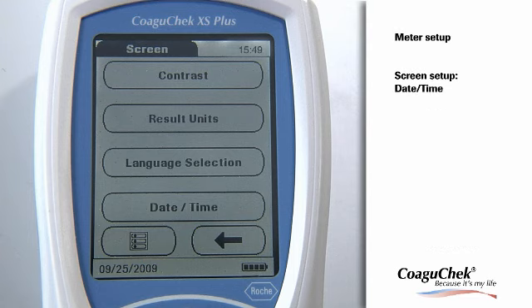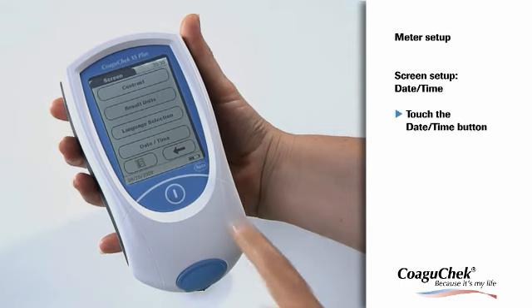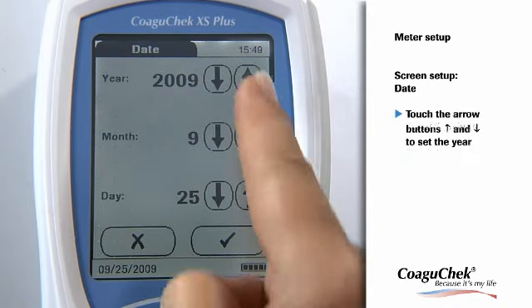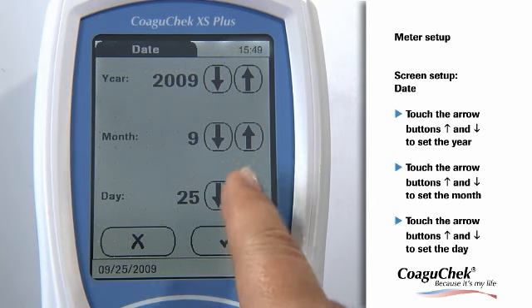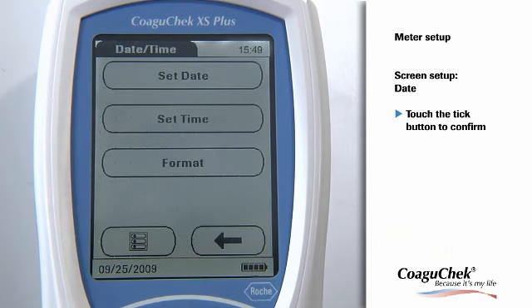It is very important to set the current date and time before the meter can be used further. Please touch the Date Time button to enter the menu. Then touch the Set Date button and touch the arrow buttons to set the current year. Afterwards, you can choose the correct month and the right day. To confirm your setting, please touch the Tick button. The program automatically returns to the Date Time menu.